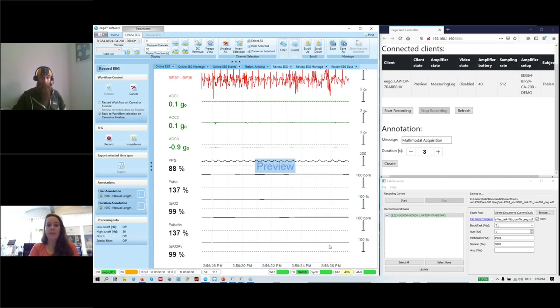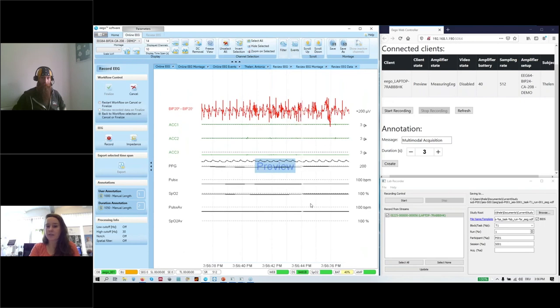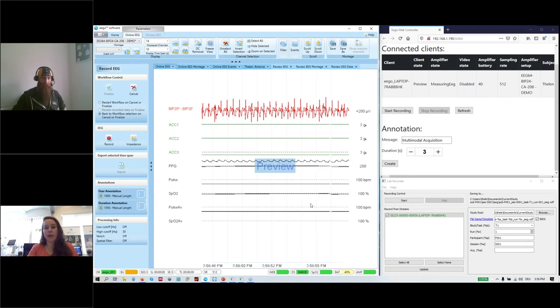So to go into my presentation, what you're going to see here on the left is the screen from EEG-O. And what I have done here today, because Sam so perfectly already showed us the EEG signal, is focus only on additional modalities. As Sam mentioned, sometimes it's very important that we can acquire data for more than just one acquisition modality, and best to do so in one single file so that we know that the data is already synchronized from the very beginning.